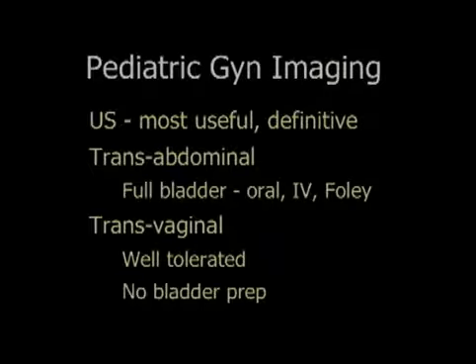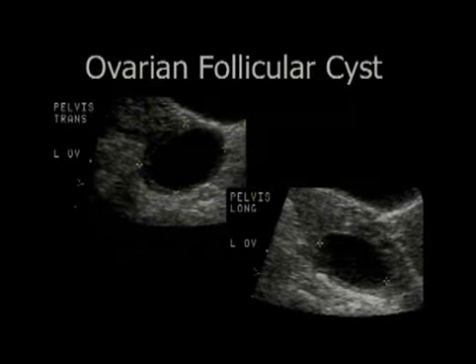Don't forget to do transvaginal scanning. If the girl is sexually active, if she uses tampons, this is a viable alternative. It's well tolerated and it can certainly save you time by not having any bladder preparation.